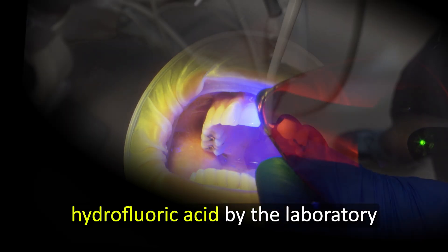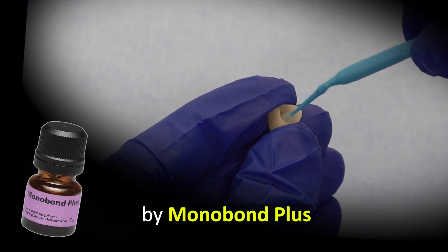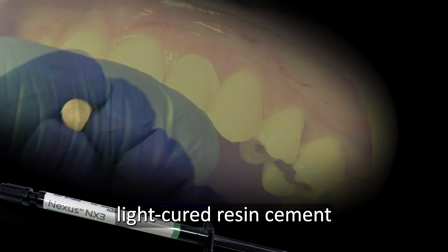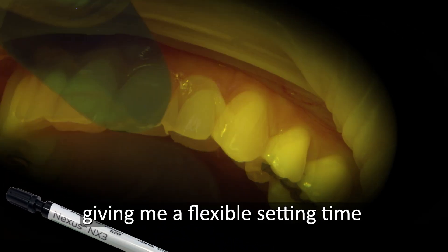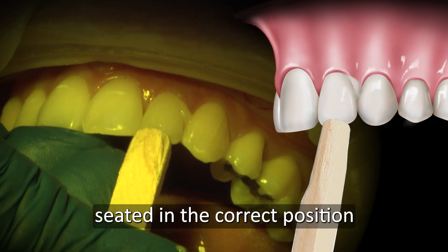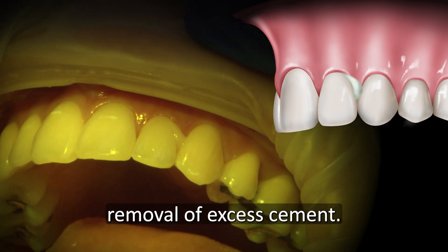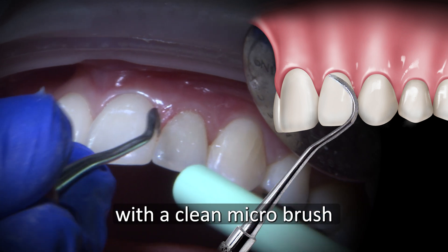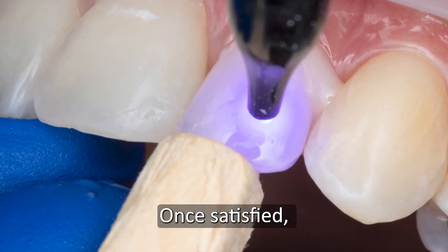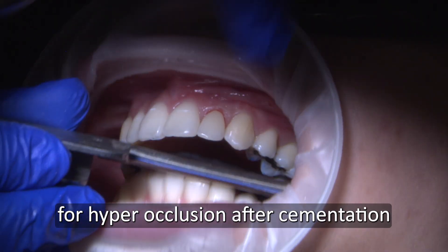The inside of the crown was previously etched with hydrofluoric acid by the laboratory to create micromechanical retention. Chairside, the inside of the crown is treated with Silane by Monobond Plus to act as a coupler for the crown to the cement. I used NX3 Nexus 3rd Generation Light-Cured Resin Cement to bond the crown onto the prepared tooth, giving me a flexible setting time to correctly position the restoration. Applying gentle pressure with a bite stick helps keep the crown seated during curing. Tack Cure Mode is recommended for predictable curing and easier removal of excess cement. I gently removed excess cement with a clean micro brush and scaling instrument. Make sure not to fully cure until the interproximal areas are cleaned well. Once satisfied, light cure each surface for 10 seconds to complete the process. I always recheck occlusion afterwards for hyperocclusion after cementation.